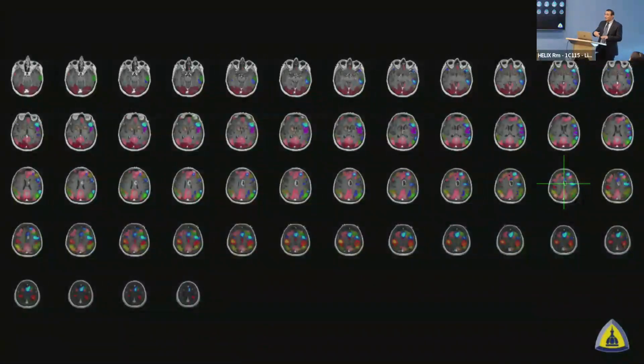Sorry, not the supplementary motor area, the pre-supplementary motor area. So the SMA is hard enough to get with resting state fMRI, but now he wanted to do one that was even harder to do, which is the pre-SMA. But thankfully, the powers that be were kind enough for this particular case. And then the supplementary motor area showed up like the strongest I've ever seen in any patient.